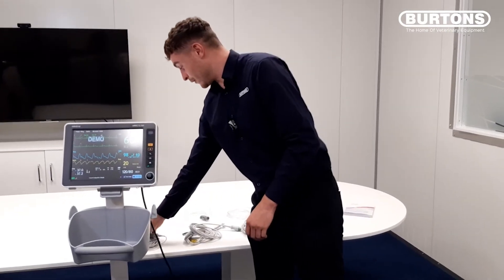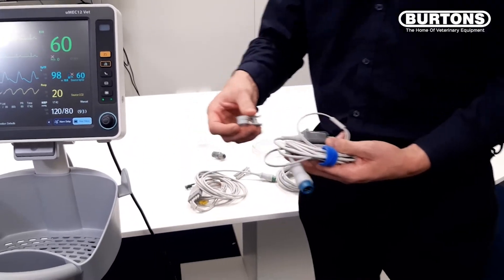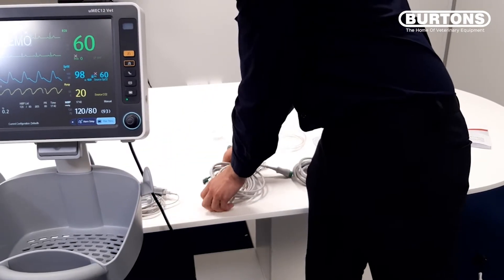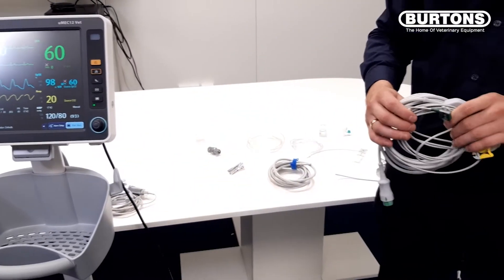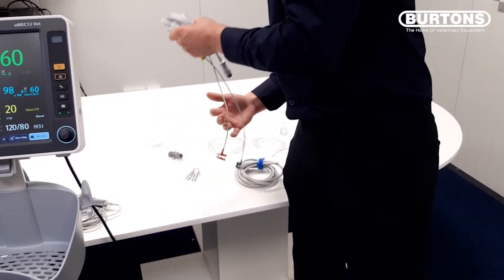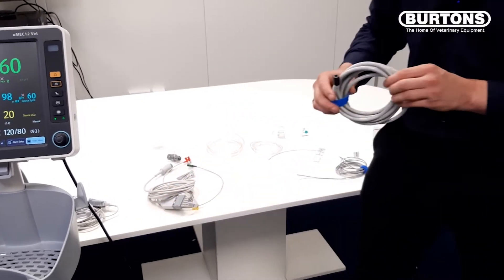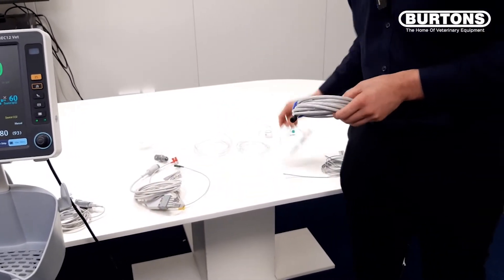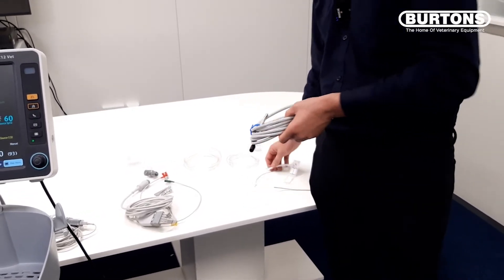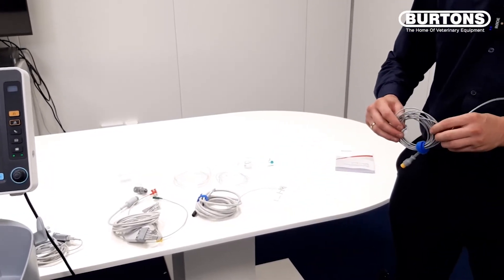We'll start off with the SPO2 cable, and you will also receive a small pulse ox clip as well. Moving on to the ECG lead, which you will also receive ECG clips as well. Then we'll move on to the blood pressure hose, which you can attach your cuffs to, and we also get a whole range of cuffs with the monitor, and we have our temperature probe.